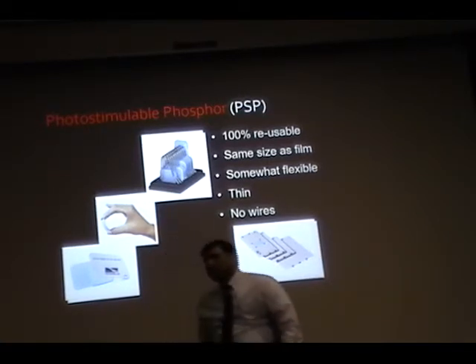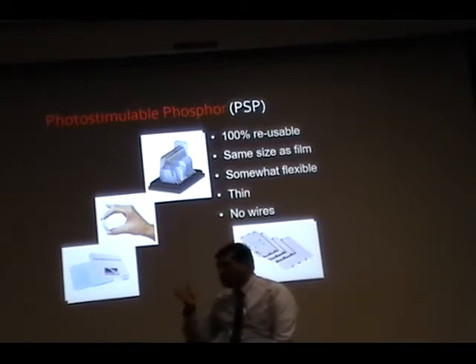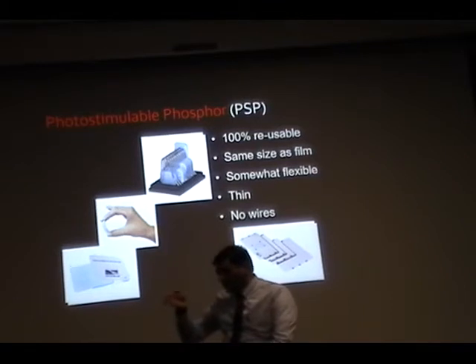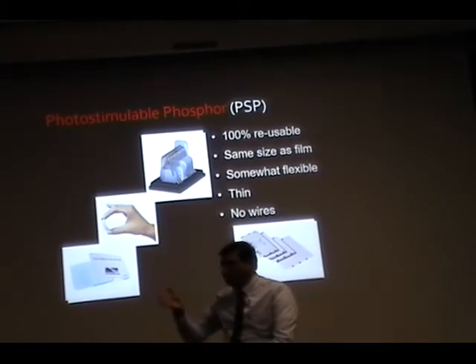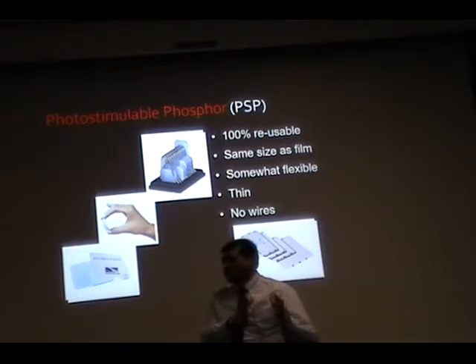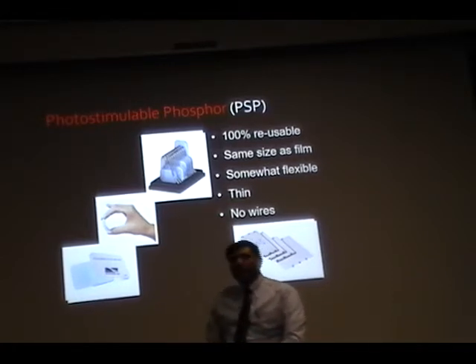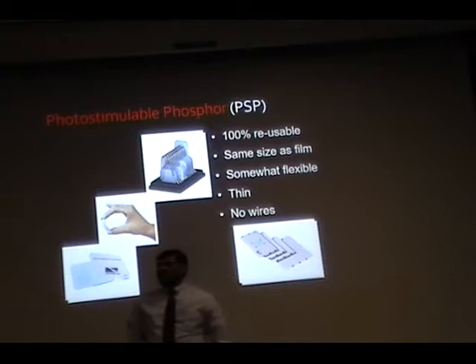Depending on your diagnostic test, I would say you have to choose. If you're looking for any periapical pathology, and you're not able to see it with a direct digital sensor because you cannot bend it, then it's useless. But if you are only checking for an overall 6-month recall, you know that nothing major could have happened in the last 6 months, so you can go with the direct digital sensors. Make sense?